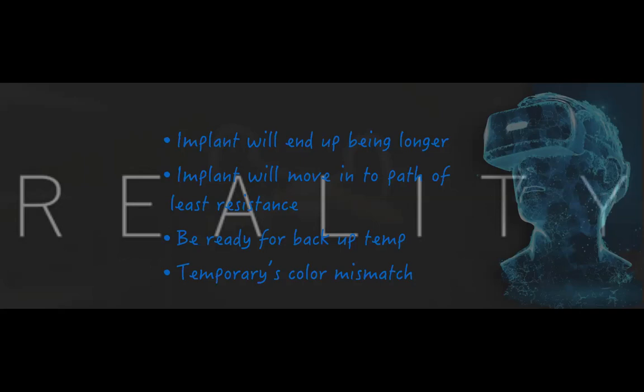But I keep on putting my OmniVac guide or whatever guide that you make back and forth in the patient after each osteotomy. And also at the very, very end, when I place an implant, check yourself to see if you placed the implant exactly where you made your first osteotomy. You want it to be easy, you could do computer guided all the way to the very, very end. You place an implant in there with a guide and it goes right in, okay?